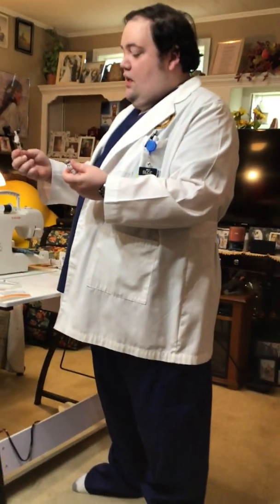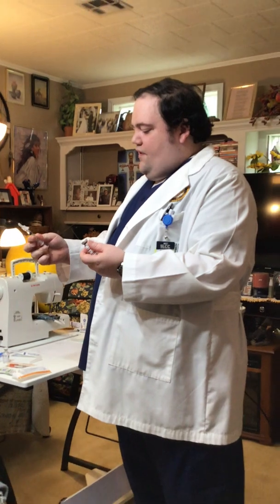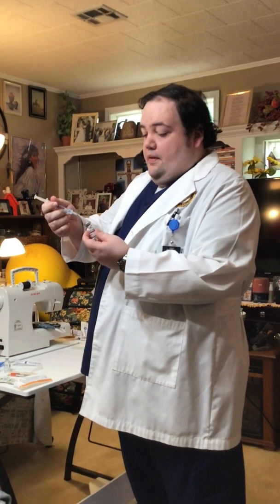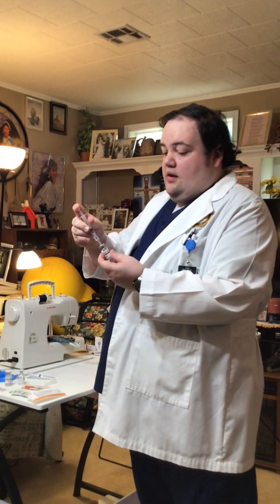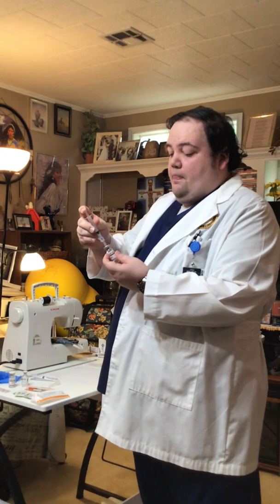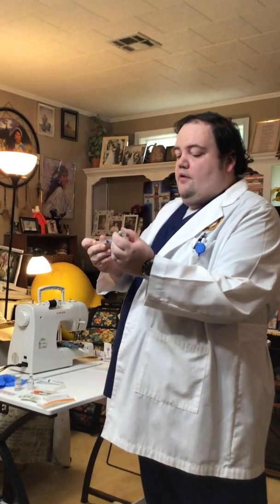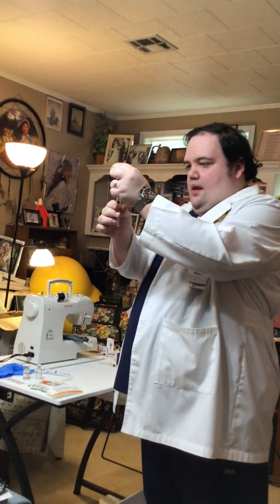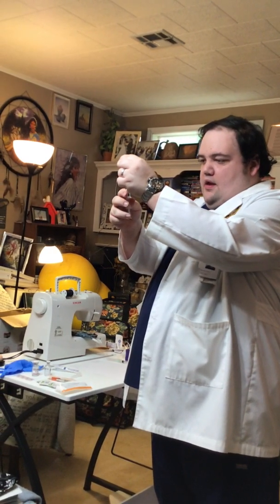I'm going to aspirate 1.5 cc's of air into this syringe. I'm going to insert it into the vial, and I'm going to inject the air into the vial. Okay. I'm going to invert it and let the air push out the medication that I need. And it didn't quite go all the way, so I'm going to help it out a little bit.